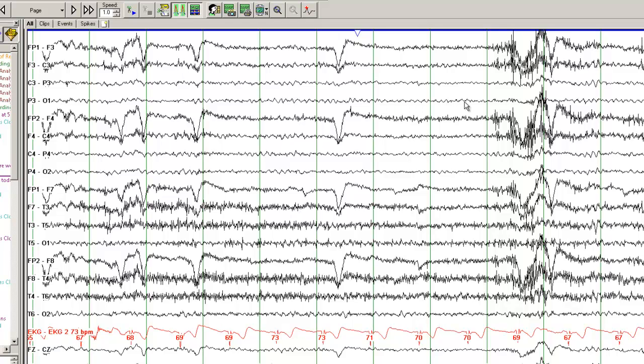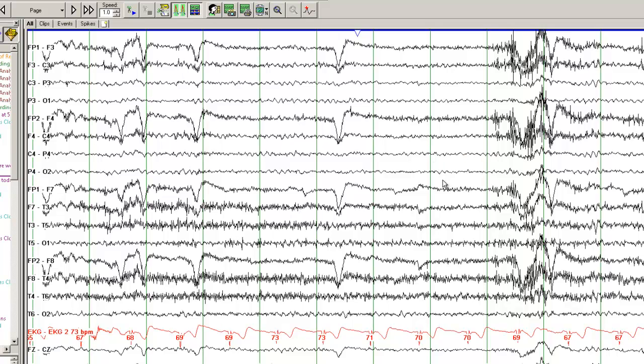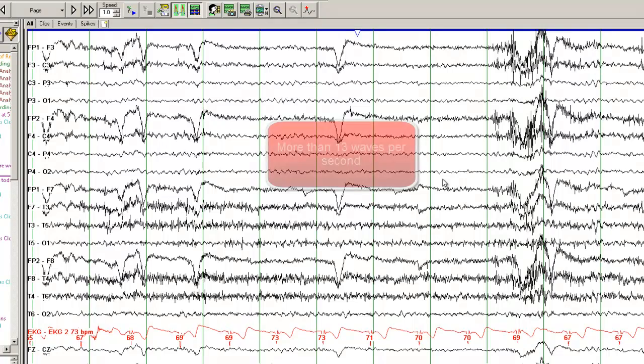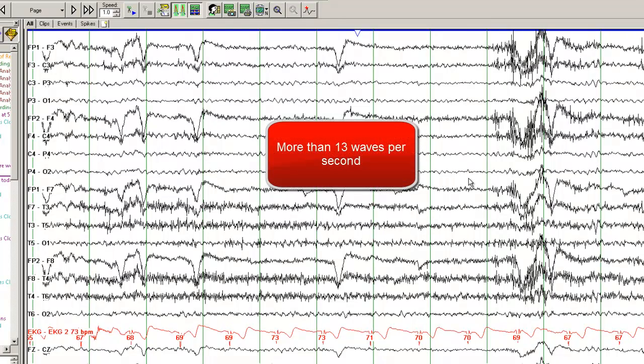So go back to the previous tutorial, EEG 101, beta activity or beta frequency is frequency when the number of waves in one second exceeds 13 waves per second. So the two green lines are separated by one second, and if you have more than 13 waves in that one second, you call it beta frequency.